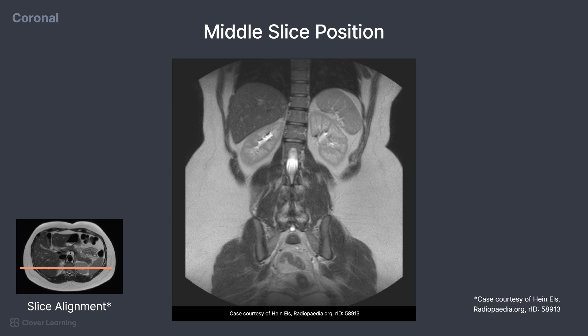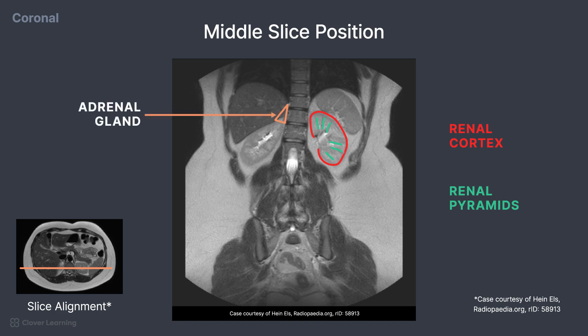More details of the kidneys are demonstrated here, including the cortex, or outer covering of the kidney, and the renal pyramids, the more inner portion of the kidneys. On the right side, the triangle-shaped adrenal gland can be seen superior to the kidney.